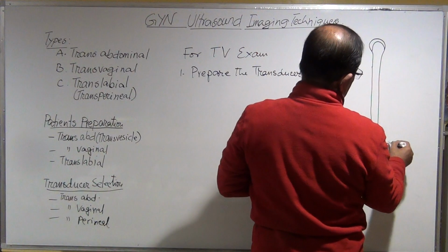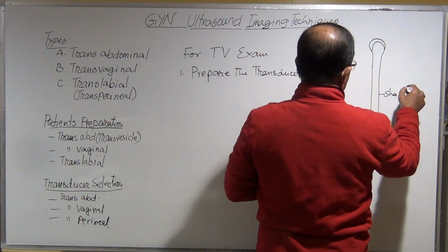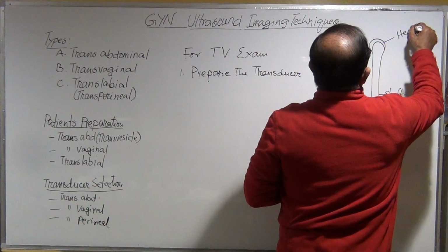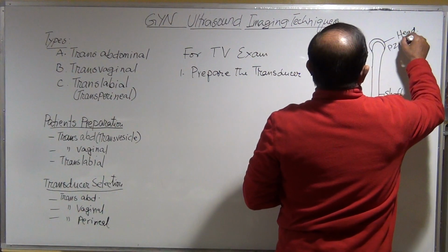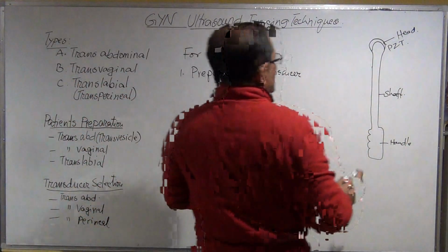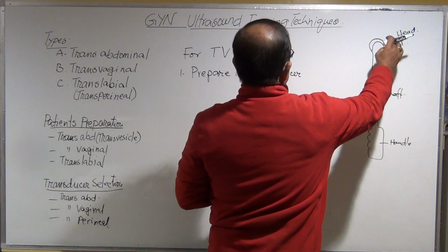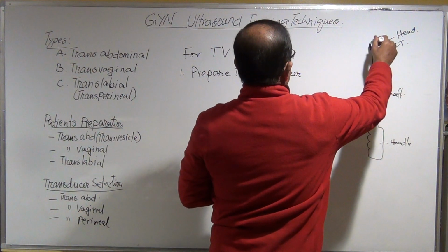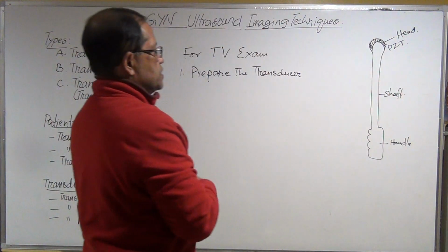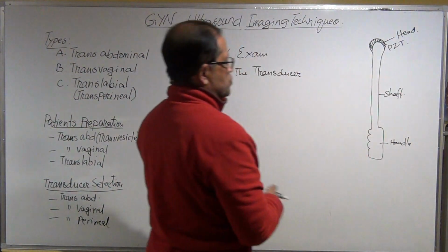So this is the handle, this is the shaft, and this is the head, and that has PZT. Okay, this is the shaft with the transducer that has a head, and that is a PZT, that is a crystal. It's a high frequency crystal.